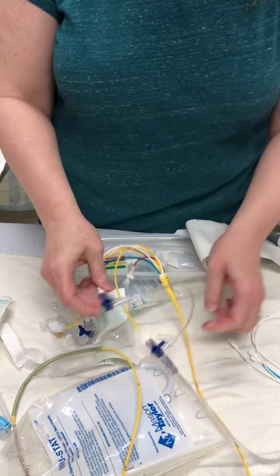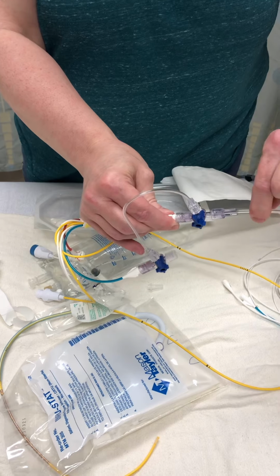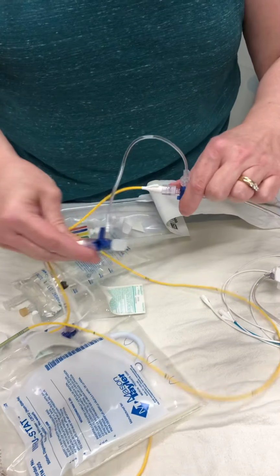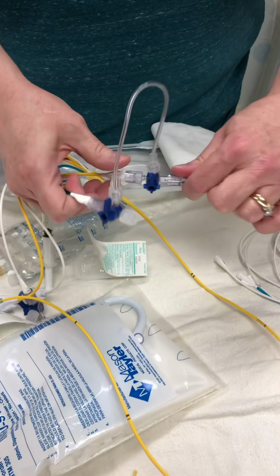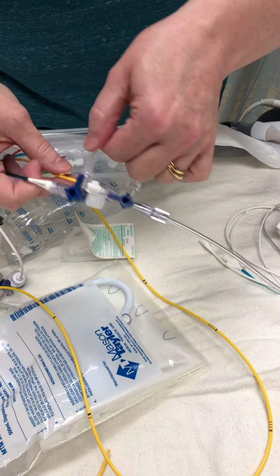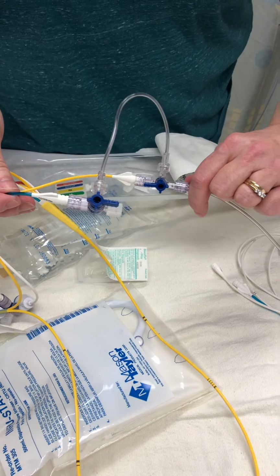And go from the yellow port to the blue port. So when you're monitoring on a regular basis, the fluid will be looking at your yellow port, your pulmonary artery. If you want to get a CVP, what you want to do is look at what's going on here. So you close off to the yellow port. The fluid will look to the blue port, and you're going to let it look at the blue port. So off to yellow, on to blue.